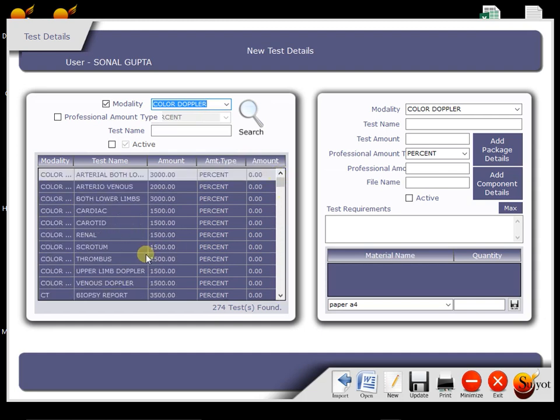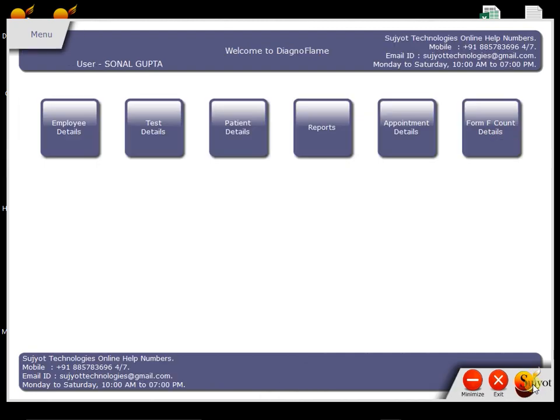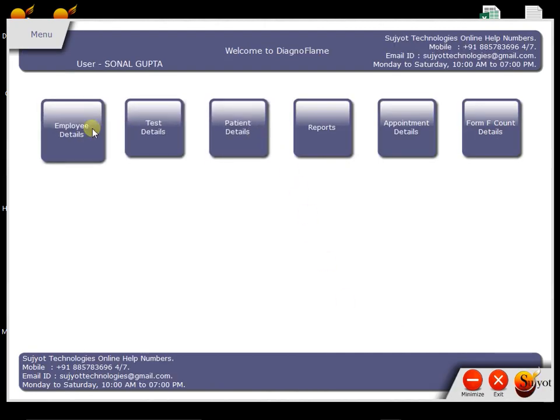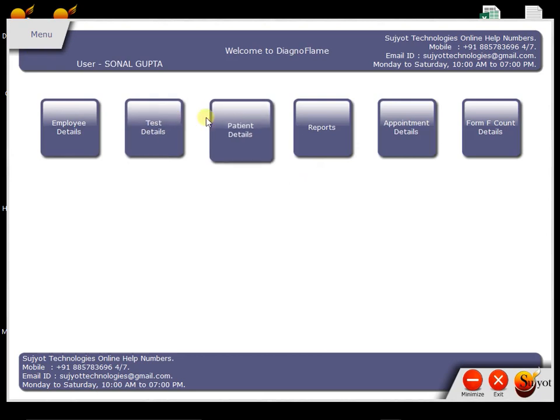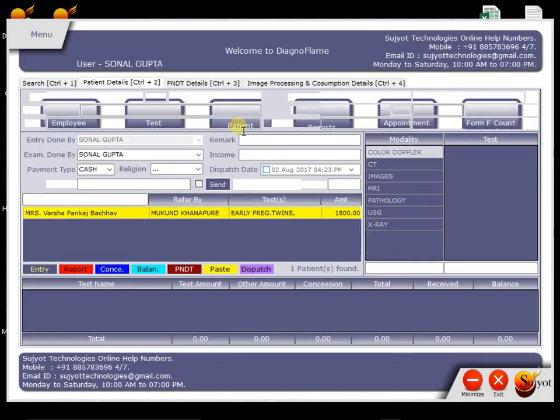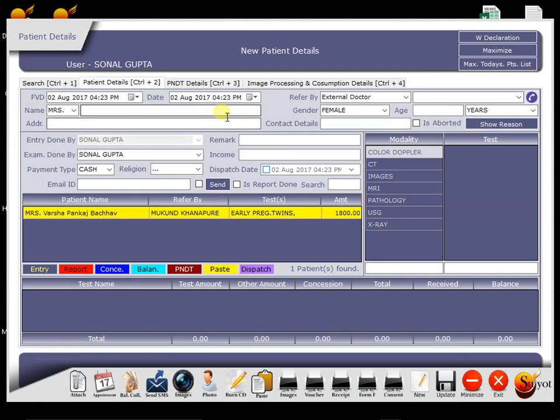You can also use your own report format templates in the software because many doctors are habituated with their own report templates. So it will be easy for them to use this software without losing their tempo. Now we move to the next important section. Till now we have seen All Masters menu in which we put all master information once so it can be easily retrieved later on in Patient Details. So here is the main screen to which we are going to interact daily. In this screen, we find four tabs.